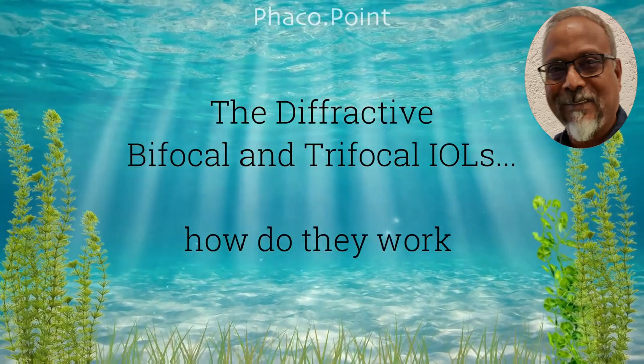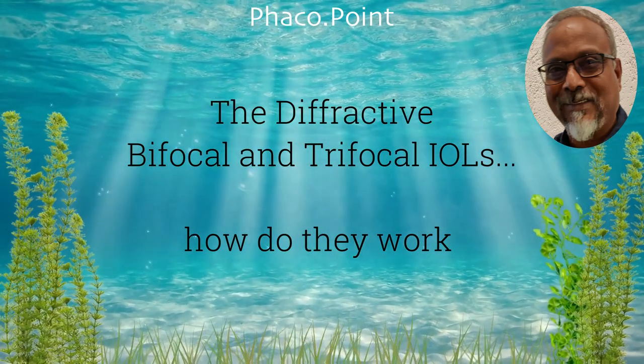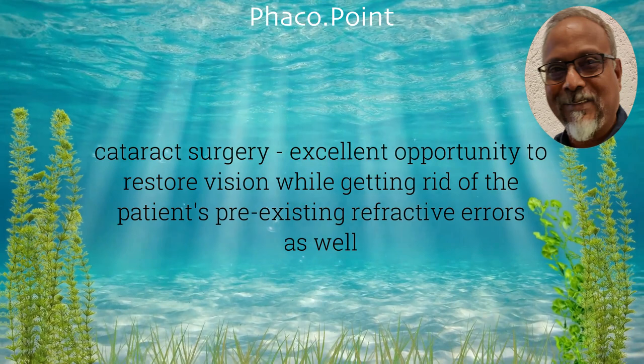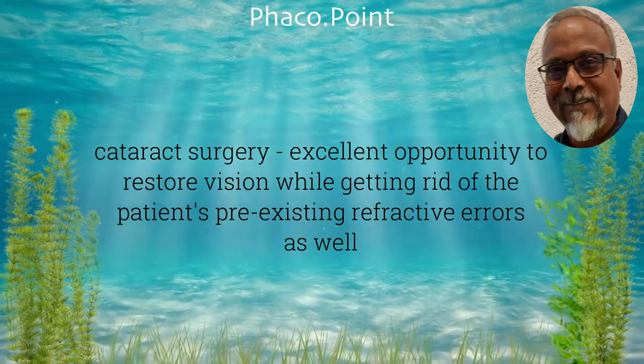My dear friends and colleagues, in this video presentation, let's look at the technology and the physics that lie behind the diffractive bifocal and trifocal intraocular lenses. Cataract surgery provides us an excellent opportunity to get rid of not only the decreased vision due to cataract, but also the patient's pre-existing refractive errors as well.